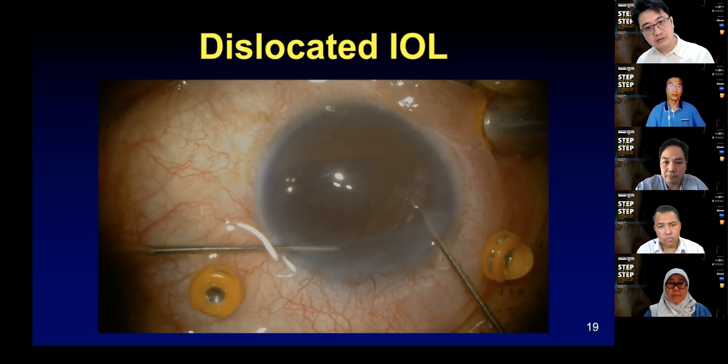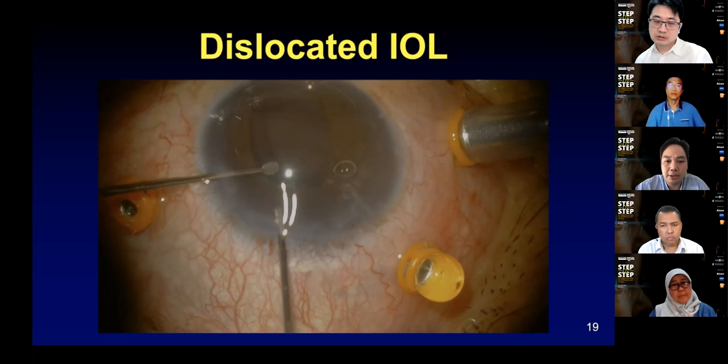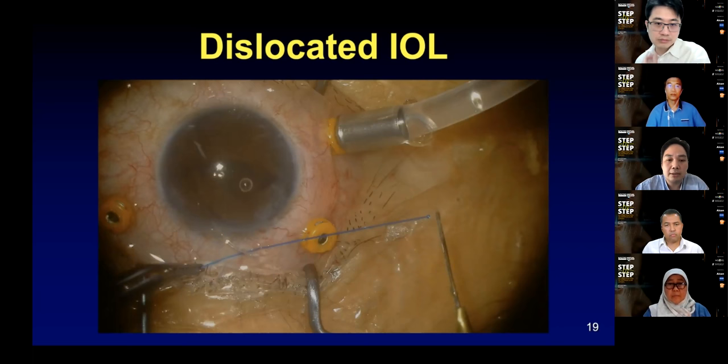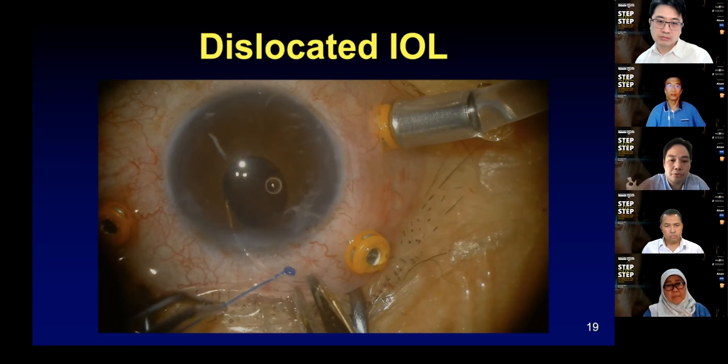Bimanual techniques are important because they always make manipulations within the eye a bit easier. So you externalize that haptic and start feeding through this 6-0 proline. I just put it through, get it all the way to how long you want it to be, and then use the cautery to create that little flange. It doesn't matter how long the proline is, but create enough of a flange so that it won't run through the eyelet. I'm making sure it's big enough so it won't do that.